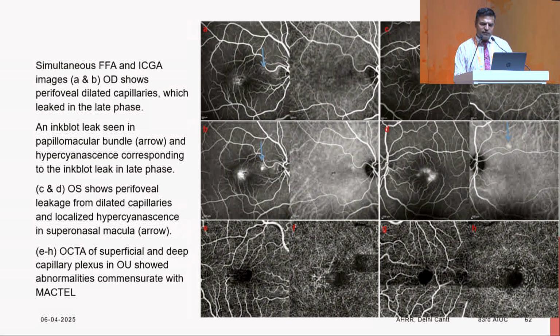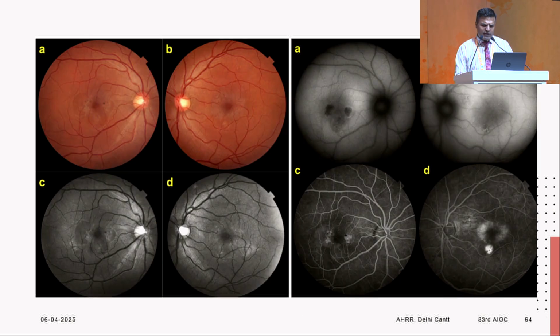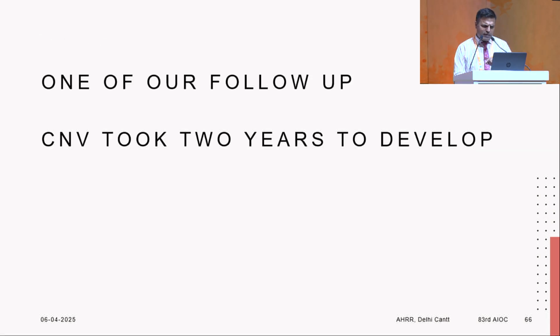Similarly, we reported this case of central serous chorioretinopathy and macular telangiectasia. And skipping to the important part, I will show you one of our follow-ups, how we are following up cases of MACTEL on OCTA and how it changes our management.